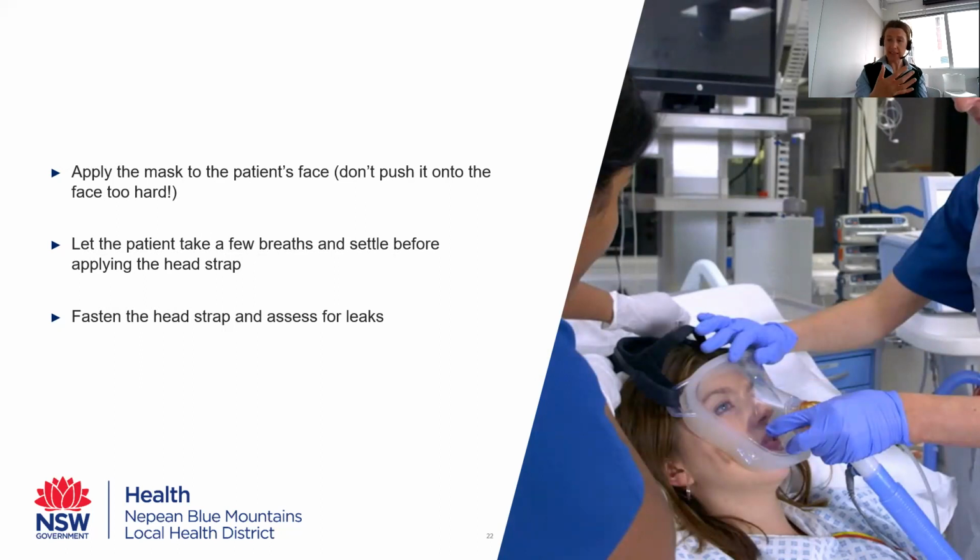And once they're there, that's great. You can pop their head straps on and fasten them and tighten them and assess for leaks. But if you do that too early, I've just found that the patients struggle a little bit more to settle because suddenly they've lost this ability to control whether it's on or off. And it increases their anxiety level, and it increases their feeling of claustrophobia. So physically holding it on for the first little while until the patient settles is a good tip for helping it be successful.